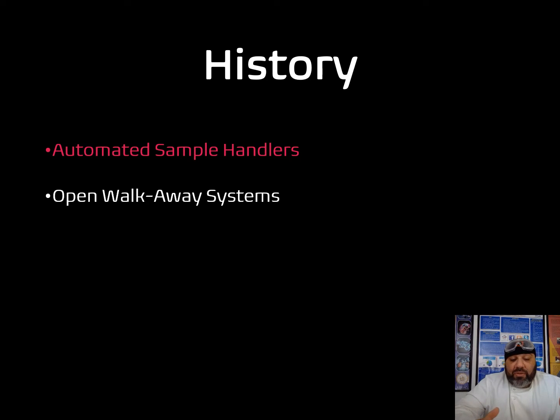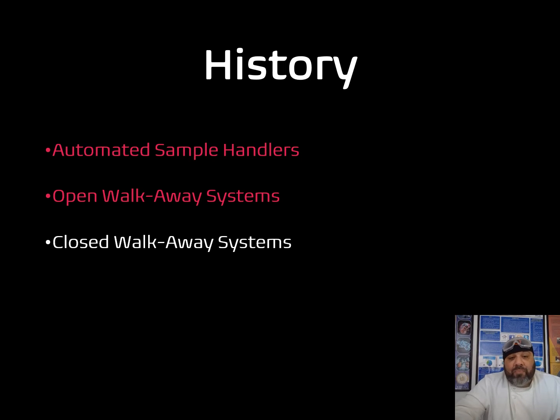So basically, wherein pathology, the robotics and the automation was, for example, fully automated. So wherein certain investigations and tests that health professionals would request on the front line would require laboratory specialists to ensure, apart from implementing the day-to-day startup aspects of a particular automated laboratory equipment, there would be those automated equipment that are referred to as, for example, open walkaway systems. There are closed walkaway systems.